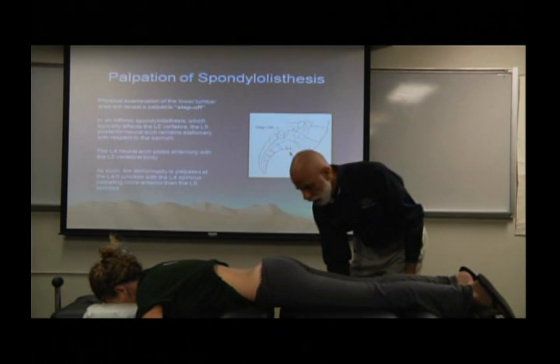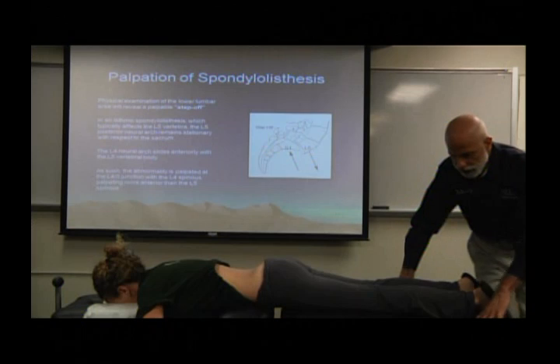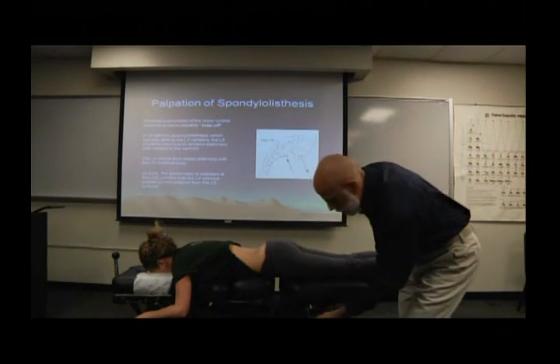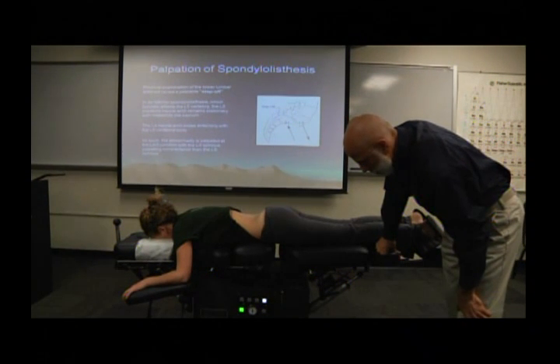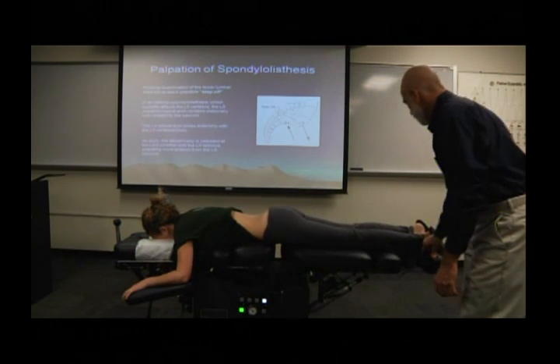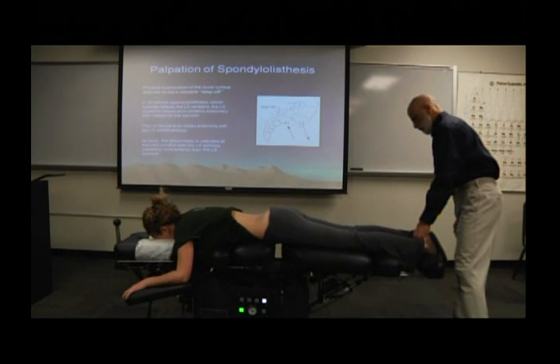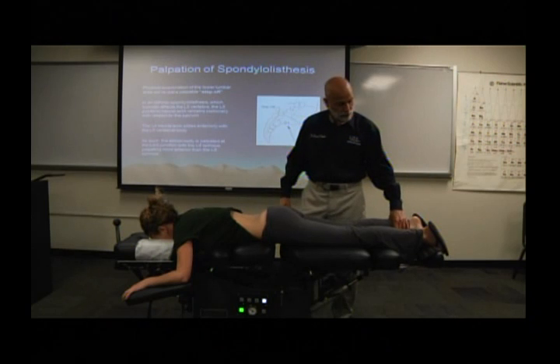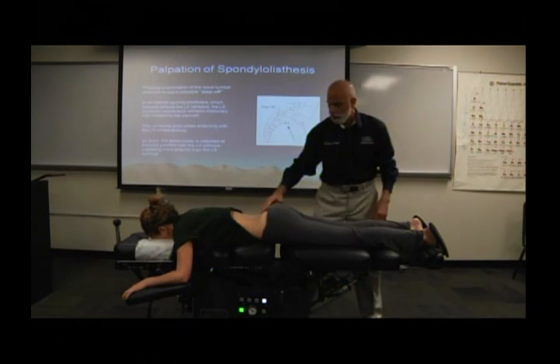Okay. So we want to stabilize a little better than that. I think we've added some air to this table. Because of the length of my arms, I do not necessarily use the tiller bar. Okay, and so you have that option as well.